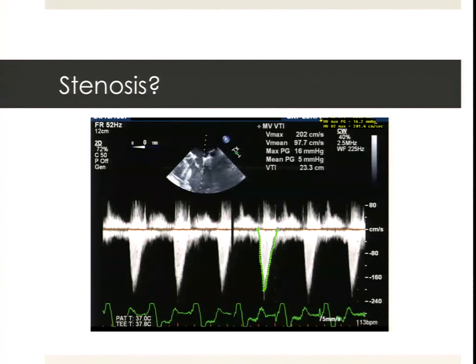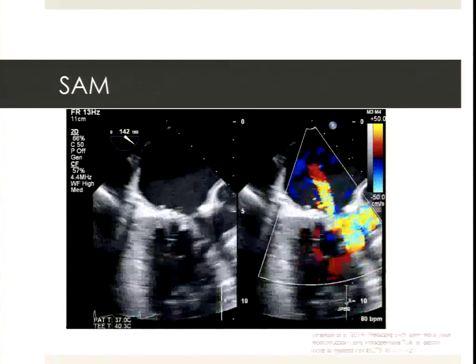Now, stenosis also is only really a problem of restrictive annuloplasty. And in a lot of ways, it's very difficult for us intraoperatively to assess that. You've already heard today about how exercise induces changes in gradients, which is more significant for trying to find functional mitral stenosis. And so unfortunately that's the situation in the immediate perioperative period, assessing that.